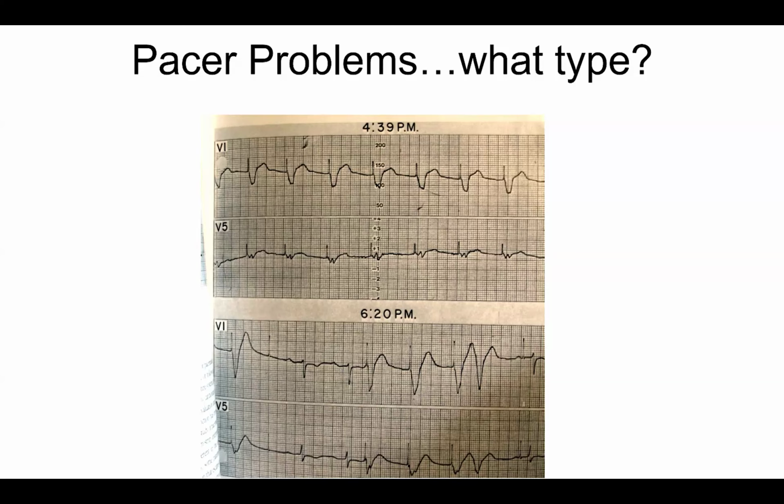They use the diathermy, which might interfere with the device. Any patient movement, any use of diathermy can affect what the pacemaker is sensing. So it might be interpreted as a heartbeat, and the pacemaker wouldn't then pace the patient as it should. Right. Electrocautery is usually unipolar, and it creates a very large electrical artifact that the pacemaker lead can sense. And as you said, it will cause pacing pause. So a patient could have very long pauses while receiving Bovie or electrocautery.